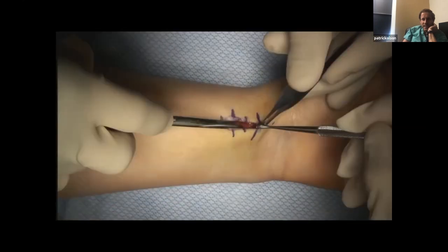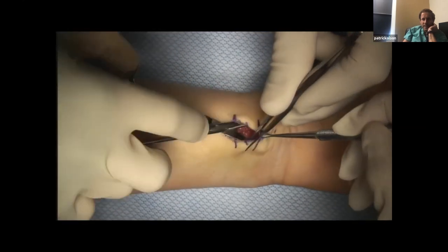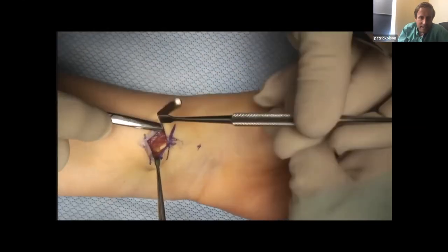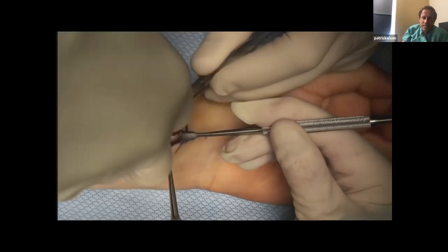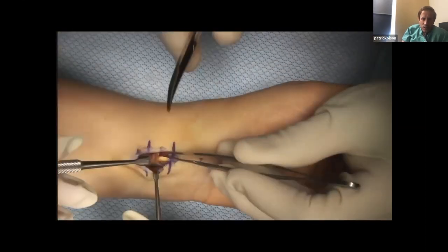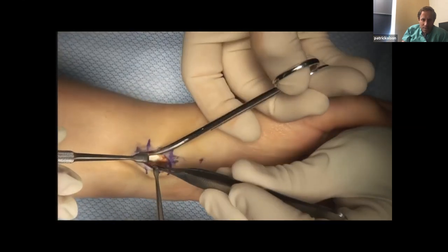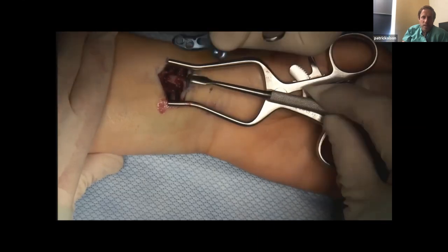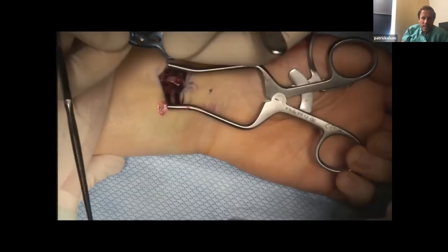We'll speed it up just a little bit. We identify the FCR tendon — there it is. Again, retract and release as far as you can proximally and distally so you can see as much as possible. Don't cut what you can't see — we know that rule. I incise through the pronator quadratus. Here's the plate.